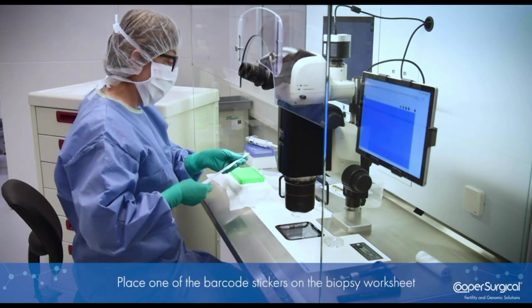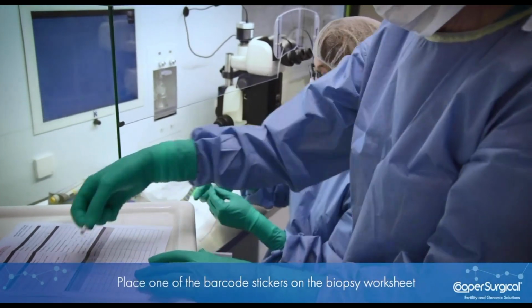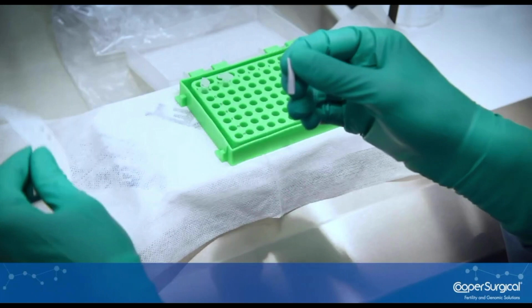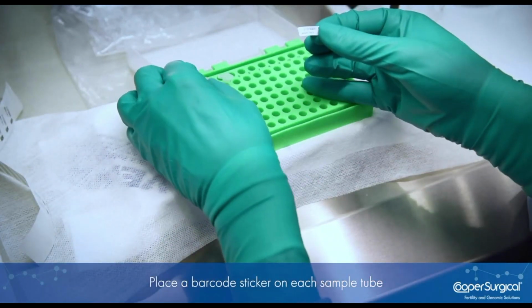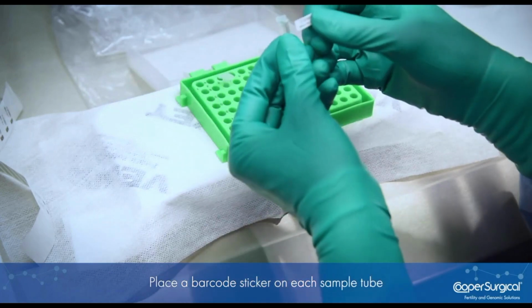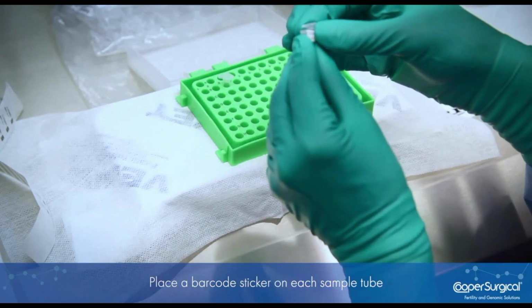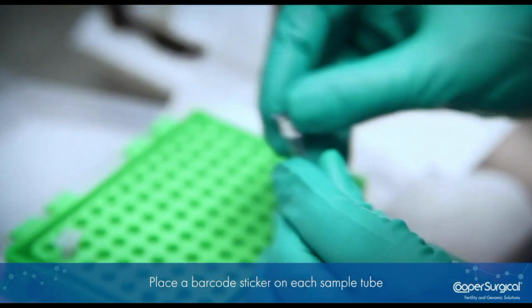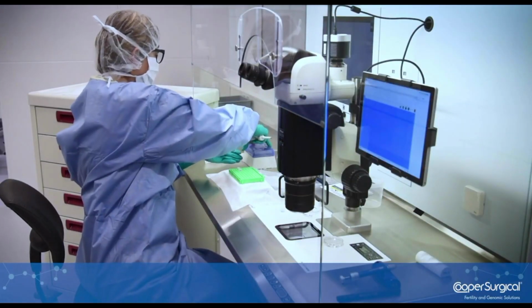We will label the tubes. For the Cooper Genomics labels, there is also a barcode, so that label needs to go as high as possible on the tube and end with the barcode. We also give one of the labels to our colleague, who will then stick this to the worksheet. So we are sure that the ID is the same on the tubes as on our paperwork, our worksheet.